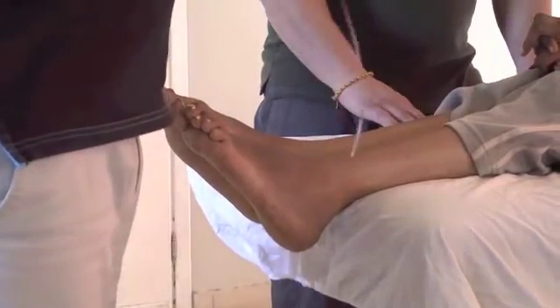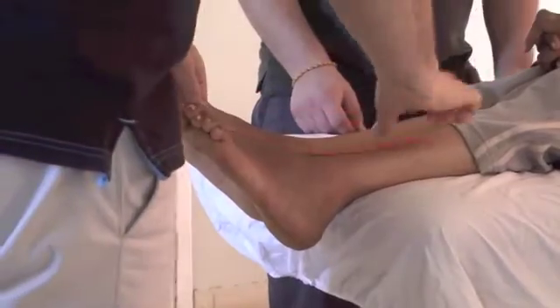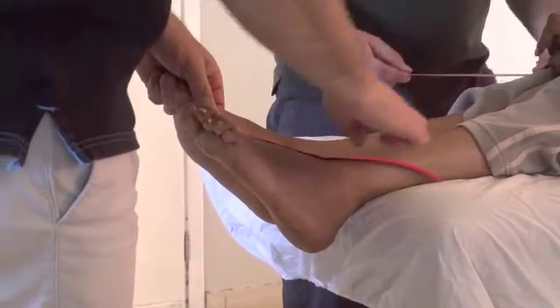Just the same as the hand. So we're going to start at the base of the toenail and then we're going to apply the tape over the whole dorsal aspect of the foot, over the anterior ankle, and then going towards the tibia.